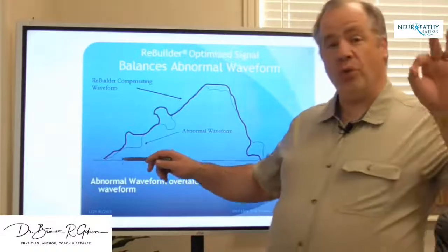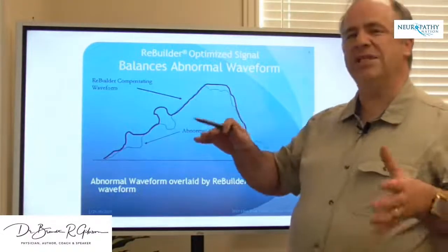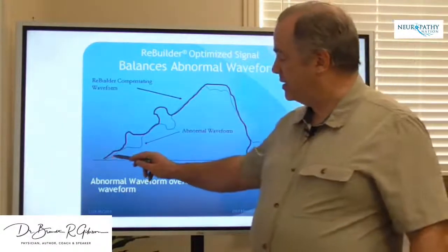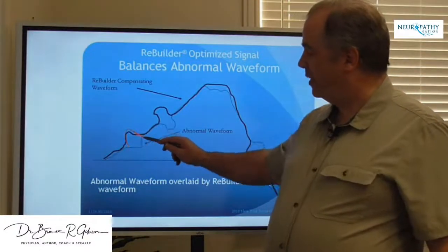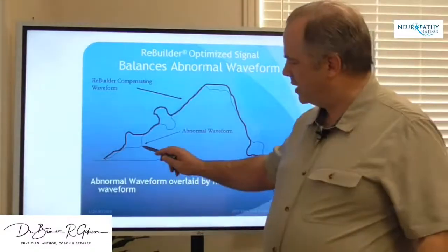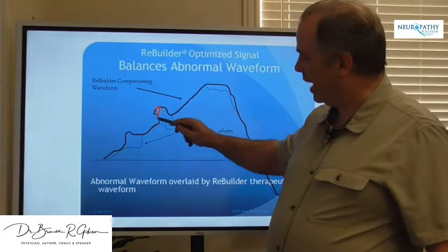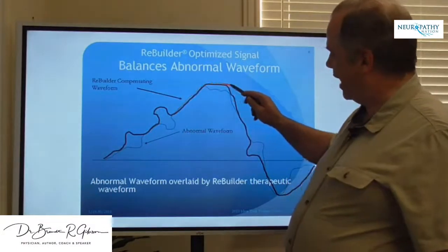But it also adjusts for and represses symptoms, but it represses them in a way that teaches the nerves to function better. So it's fixing pain. But when it gets to the area of numbness, where it says, oh, this has been numbness before, it's going to send a signal like it's trying to cause pain. And what that does is that brings this up to the normal. Again, it goes up high, which brings this to normal. And then it's going to adjust and try to make that flat across the top.